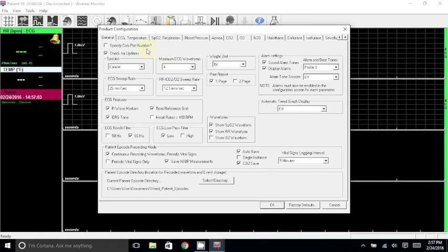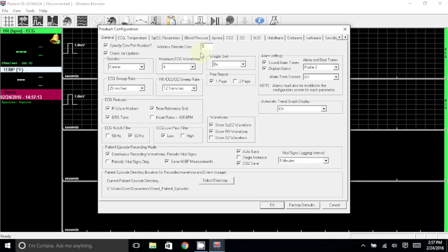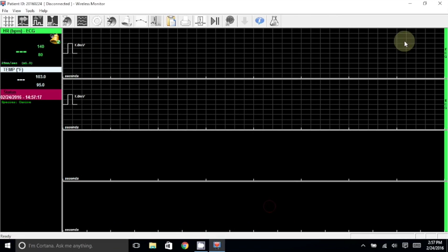Here, you will click the box next to Specify COM Port Number, and make sure that there is a positive non-zero number in the box next to Wireless Remote COM. Finally choose OK, and then Close PC Display.